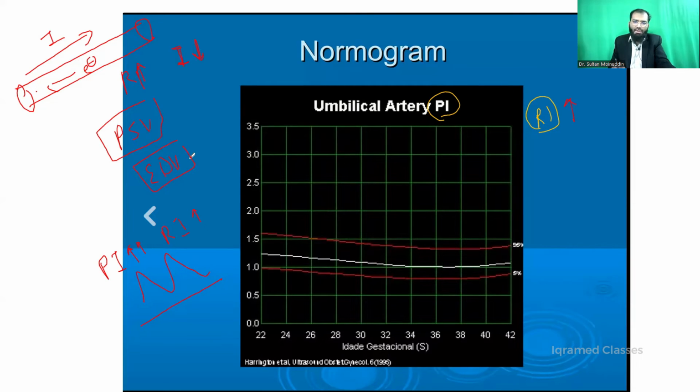This is the cord in length. Now this is the color flow within the cord. Now this is the limb which has come up. So now this is very important. Now see here, initially when we were examining with ultrasound, this loop of cord was very good. Why? Because it was a free loop. But now what has happened? The fetal part has come in between. So this might interfere with the waveform pattern and measurement. So you should wait till the loop becomes free. See now again the fetus has moved its part. The loop becomes free. And now I want to show you this waveform.